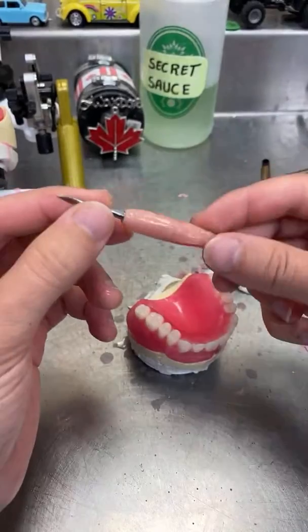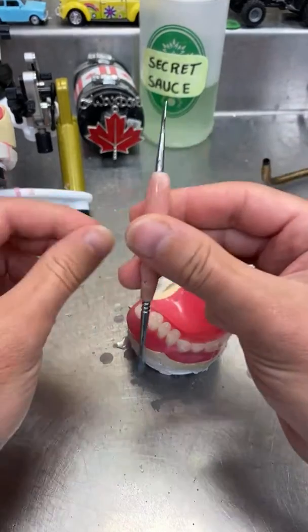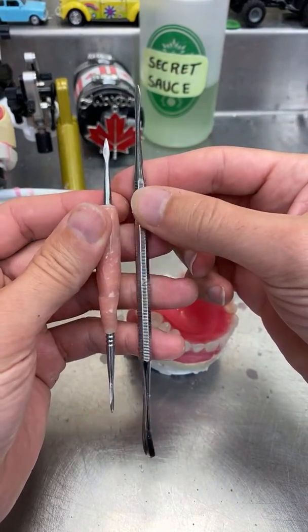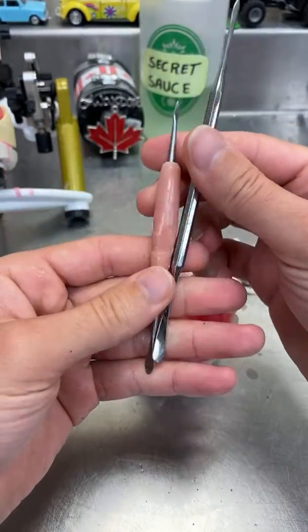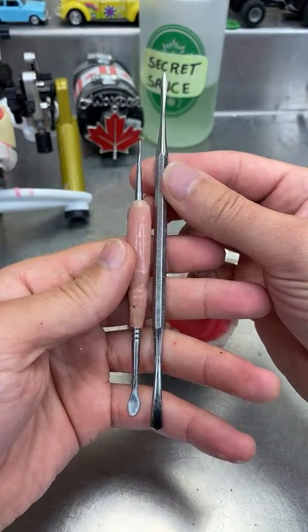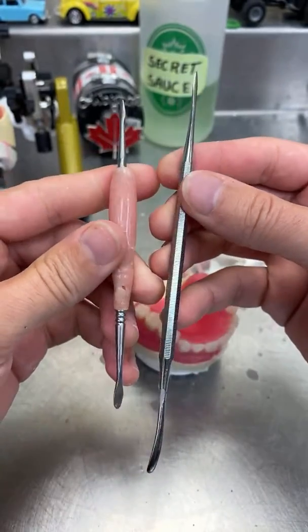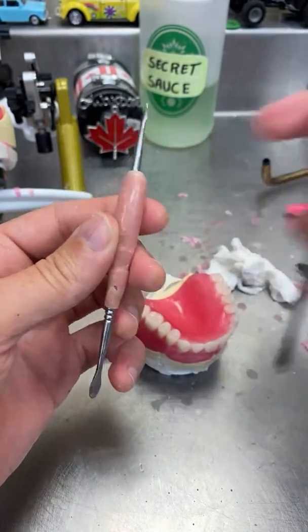Okay, this is the tool I'm using here. I made it from an old broken instrument. It was probably something like this one, but it broke, so I bent the head and carved it. It's just a homemade tool that I made from a broken instrument like this one here, and that's basically what I did with it. You can see here this is hammered and trimmed. So yeah, if you have any old tool that you don't want, you can actually make one like this.